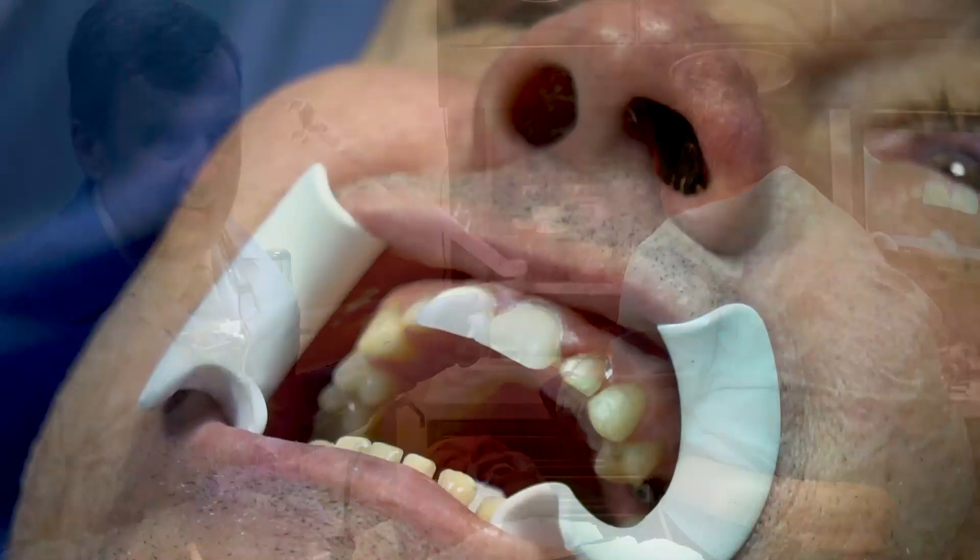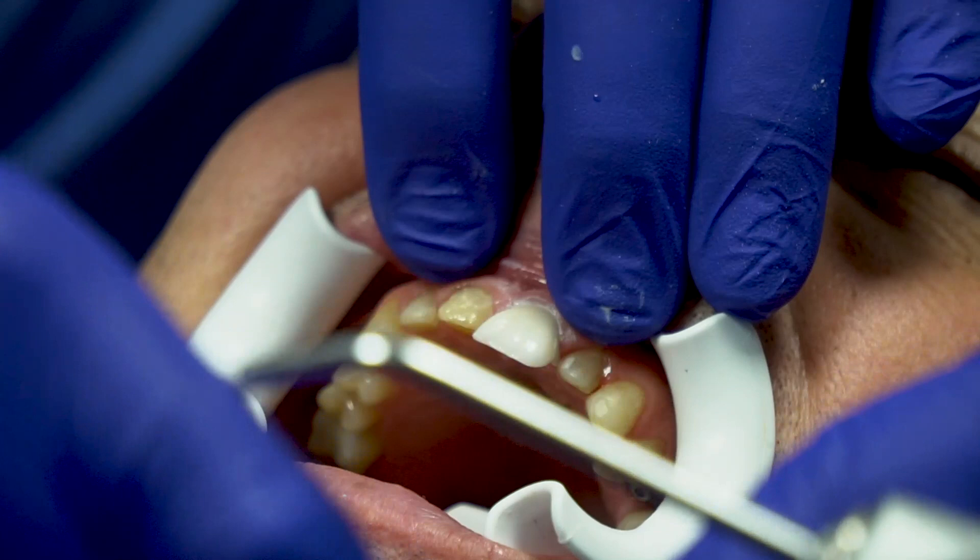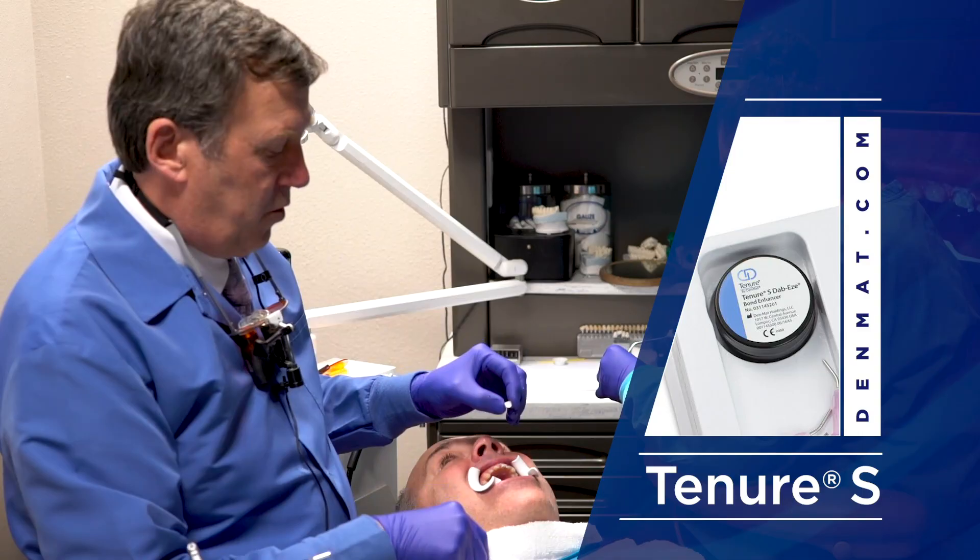These are already silaned — she does not have to re-silane them. All she has to do is blow off the excess, take an unfilled resin called Tenure S, clean out the inside, and then we just go forward.